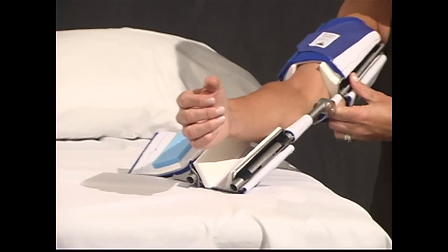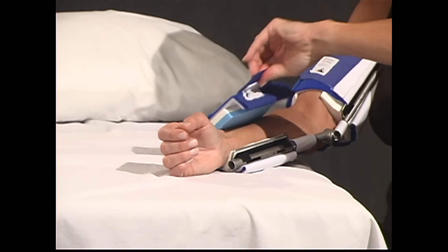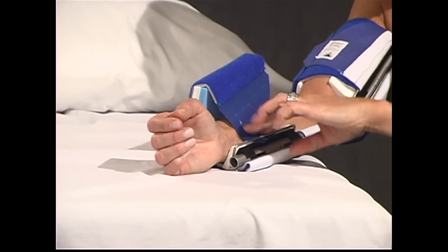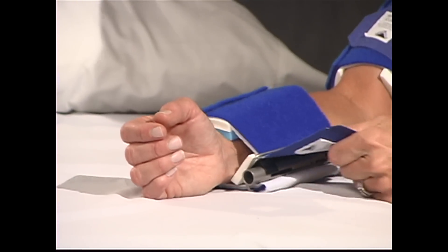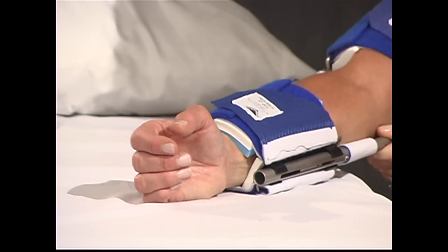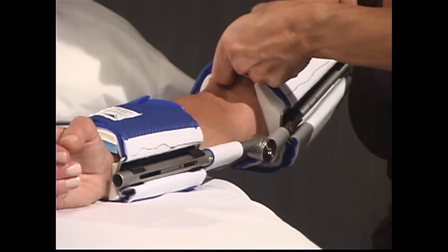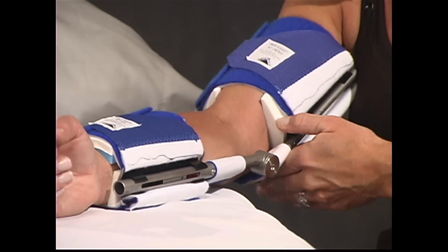Do not adjust the back cuffs. Use the line your DynaSplint representative marked on the splint as a guide. Check alignment — the struts should line up with the midline of the arm and the cams should be centered on the joint axis. Check the cuffs for tightness. You should be able to slide a finger between the cuff and your arm.